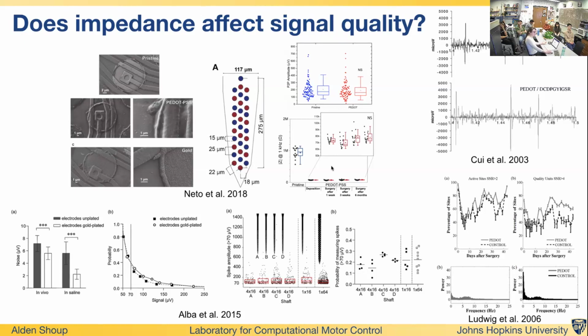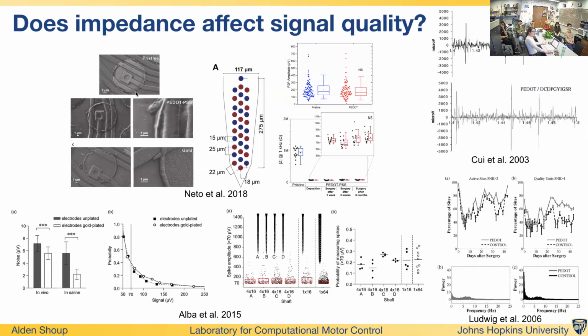So with this study, they patterned different electrodes. This is a pristine iridium contact, and then they patterned either PEDOT PSS or a fuzzy gold coating on different electrodes. For the PEDOT PSS coating, they did find a difference in impedance measurement between a non-coated and a coated electrode, but there was no difference in the recording signal sizes.